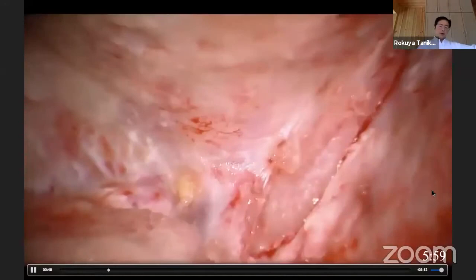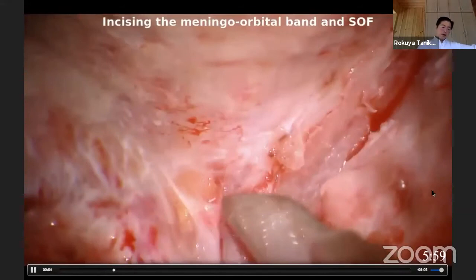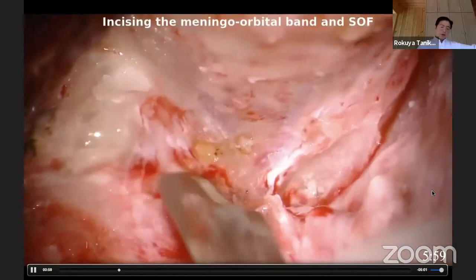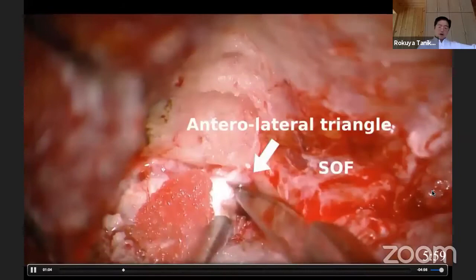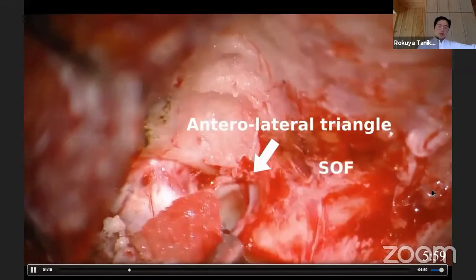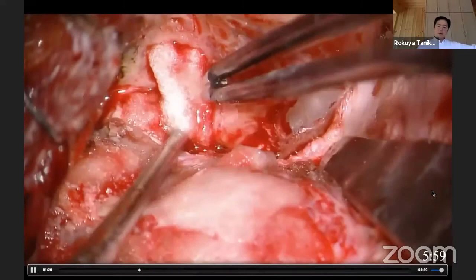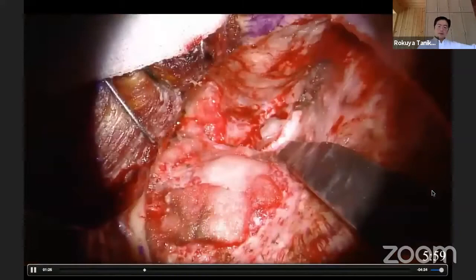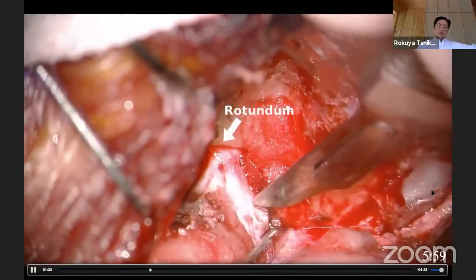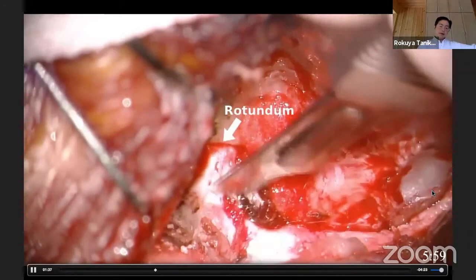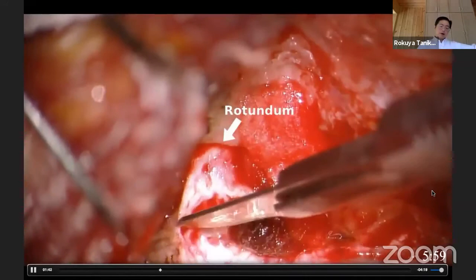So I decided to perform the epidural anterotemporal approach by incising the meningo-orbital band and superior orbital fissure. After skeletonizing the orbit, exposing the meningo-orbital band and superior orbital fissure, the dura propria is incised carefully, sharply, with a 15-blade knife, and the anterolateral triangle is partially opened. I am getting hemostasis with Surgicel and gel foam.